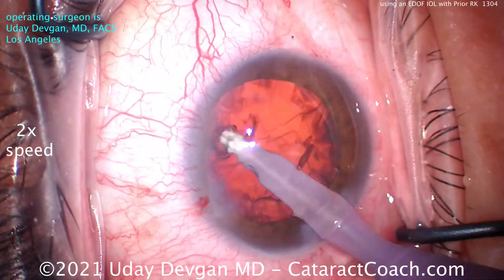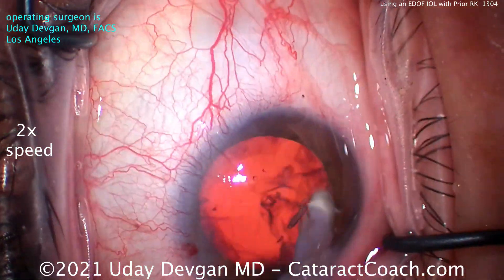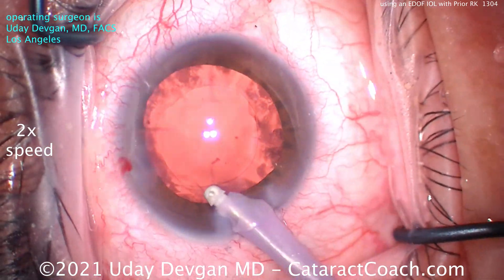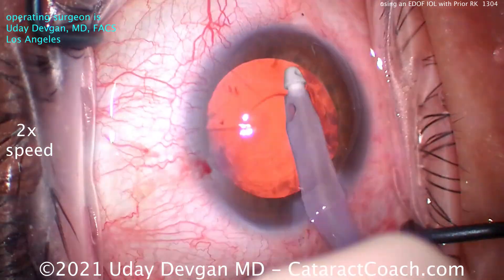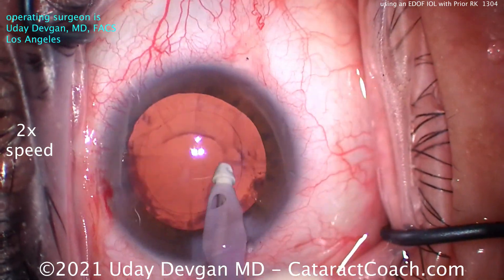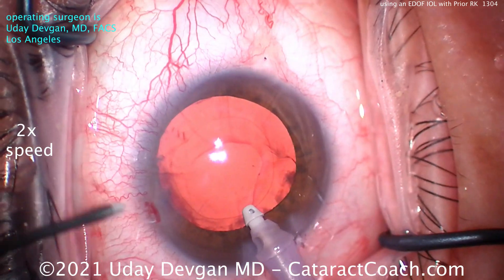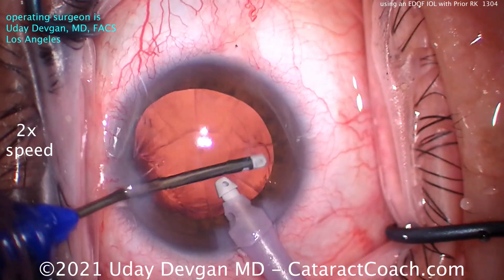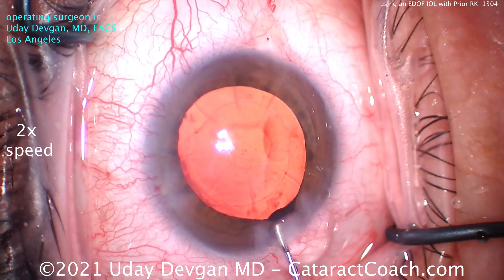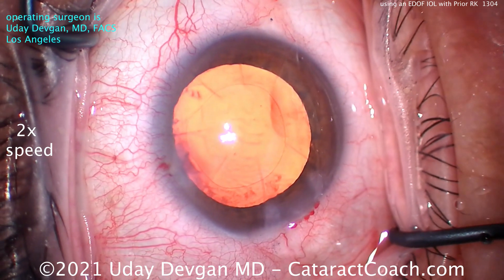The nice part of having extended depth of focus is that it gives us a little more leeway to hit our refractive target. The area under the curve for both lenses is the same — whether monofocal or EDOF — you're not increasing the number of photons entering the eye, just distributing them a little differently. But if we distribute those photons over a wider range, such as this lens which gives maybe 1.5 diopters of range, then we have a wider landing area for the refractive outcome. We're still aiming for plano, and in this case we're happy we achieved it.